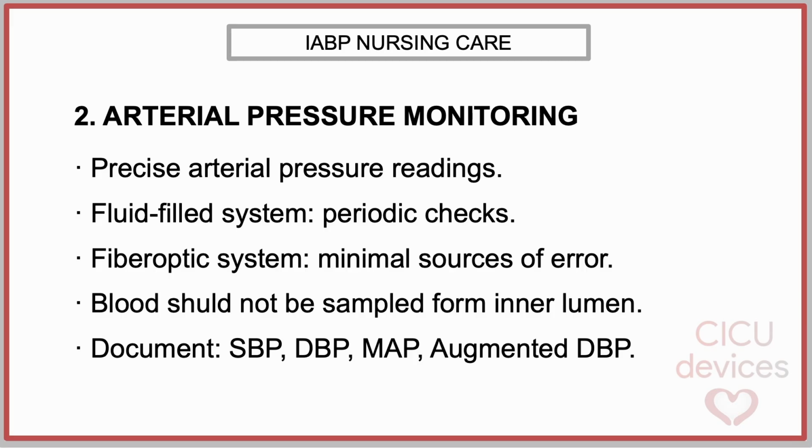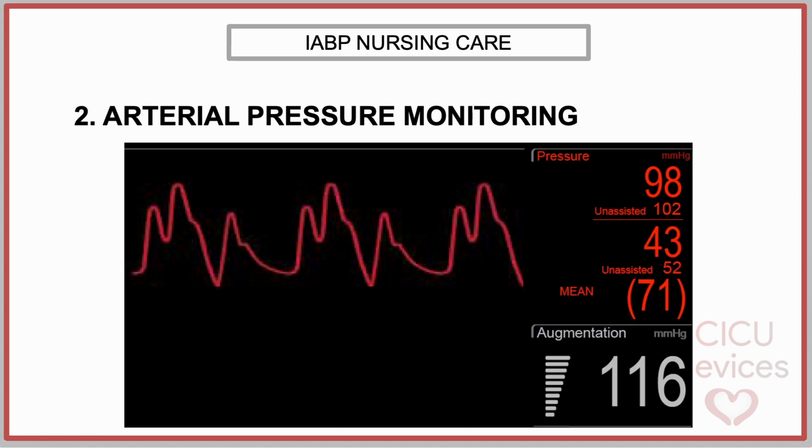It is important to remember that blood should not be sampled from the inner lumen. In addition to continuous monitoring, relevant blood pressure values should be recorded periodically.